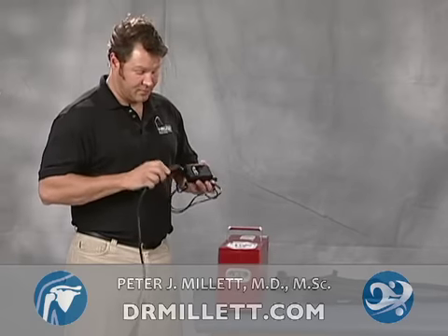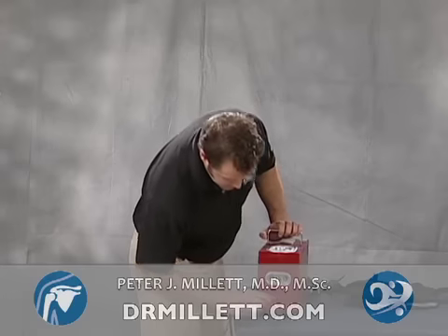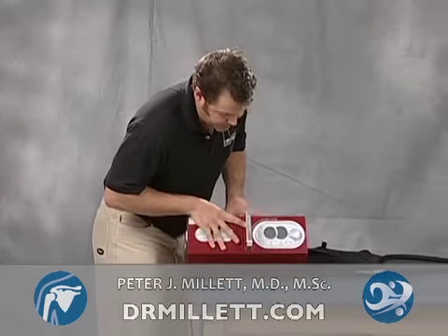To plug in the unit, plug this portion into an outlet, this outlet portion into the transformer. Make sure that this is secure, and this portion into the front of the device. The power to the Game Ready button is right here.